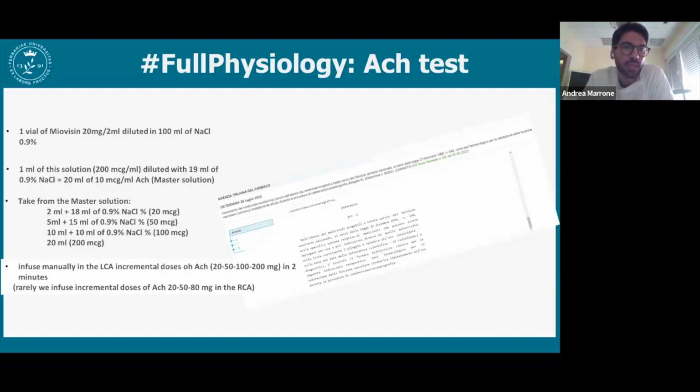Of course, if we have the suspicion for other disease, we can also perform intracoronary imaging in the cath lab. What we usually do in these cases is just try to perform the diagnosis at the same time of the procedure. So we do not usually do all these evaluations in separate sessions, but we used to perform all in one session in order to provide the patient with diagnosis in one time. So this is our protocol in most of the cases. I don't know if Simone wants to add something more.